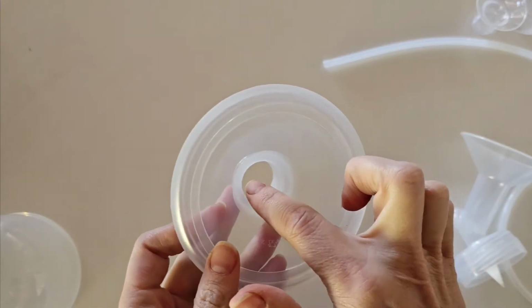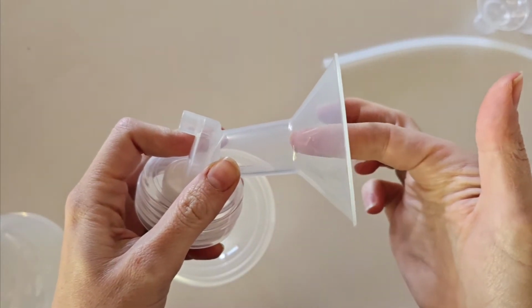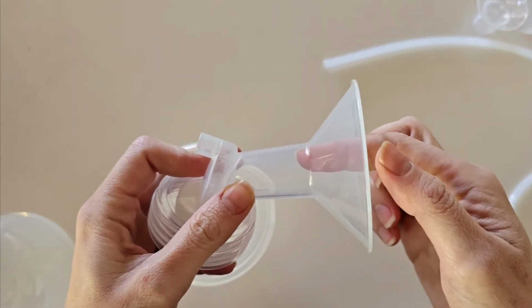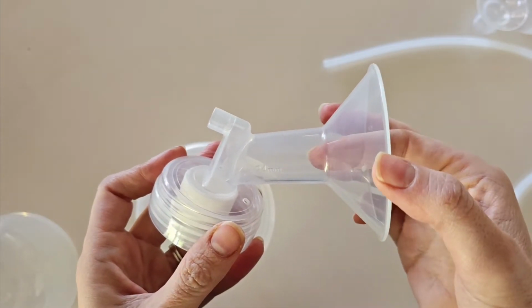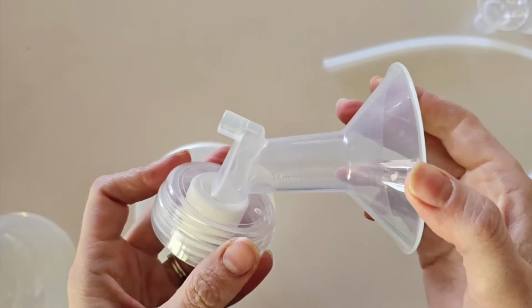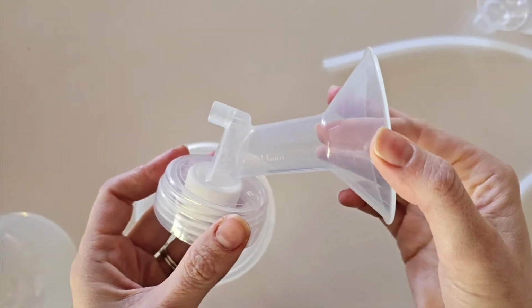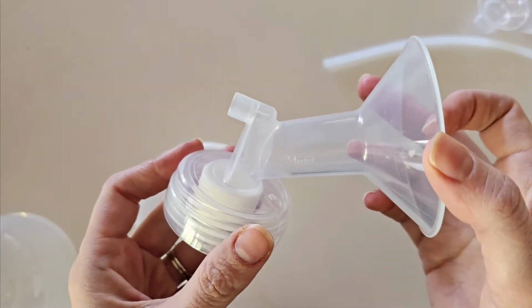Too small and it is going to not draw in your nipple and draw out the milk. Too large and you're also going to draw in your areola. So you're really going to want to make sure that you have the right flange size so your nipple can move freely in and out without drawing in your areola as well. Now, this is important because if it's too small and pulling, it is going to really rub on your nipple and cause a lot of pain and damage.